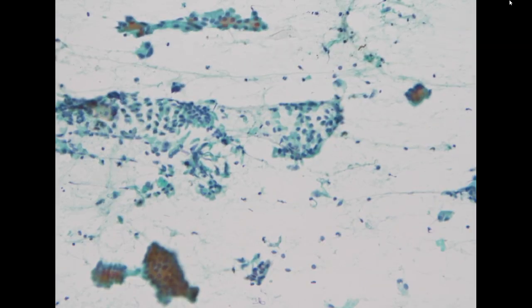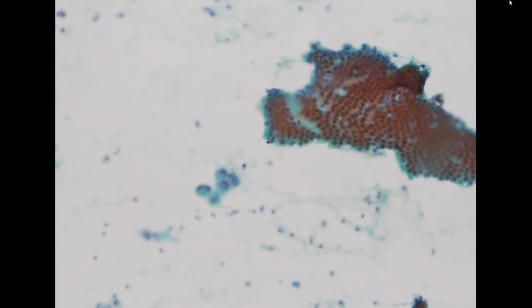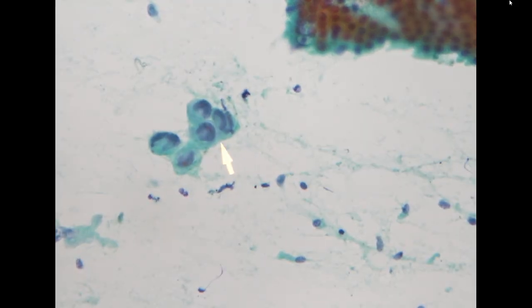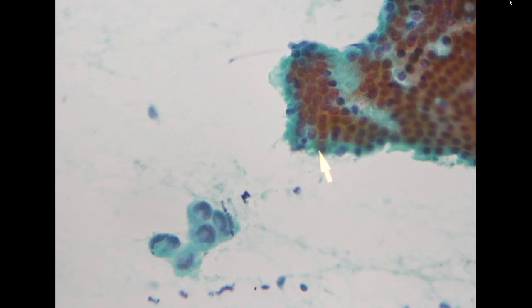Malignant cells can be intermixed with some benign cells, and sometimes it is not easy to pick them up. But in this case, because the tumor cells are very high grade, not low-grade tumor cells, it is very easy because you can easily see the contrast between the normal cells and the tumor cells. So this is pancreatic adenocarcinoma.